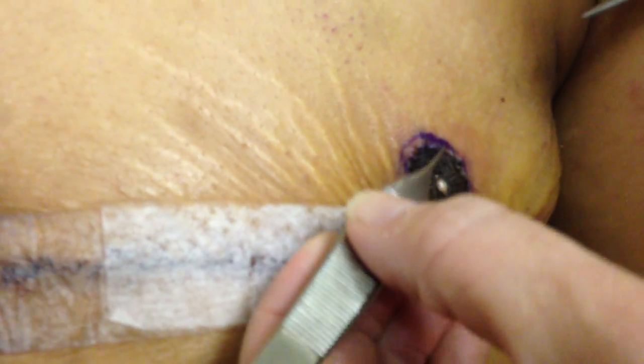There's a little bit of discharge at the front and top of the nipple there, and that's not unusual — that does happen and we'll clean that off in just a minute. Now right at the top here there is one little knot so I'm just going to clip that, and then there's a stitch that runs all the way around. Sometimes it's a bit difficult to see, and if you don't get it today, usually within the next few days you can get it. But I sort of know where it is so I'm going to go after it.